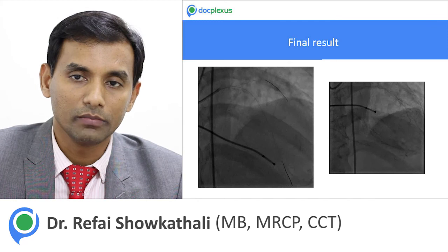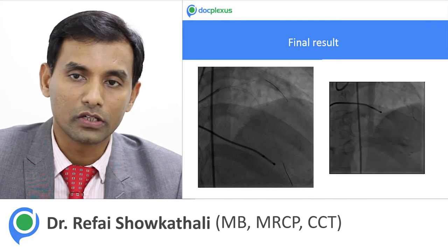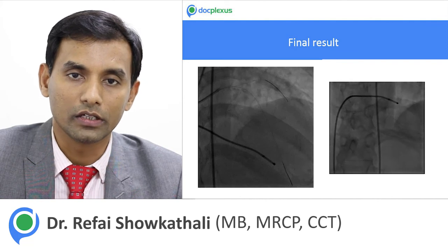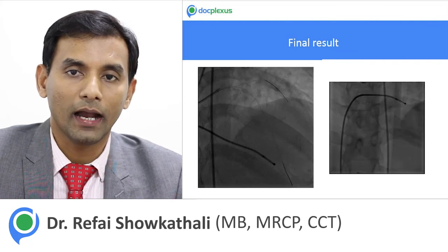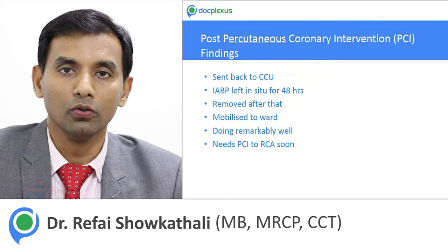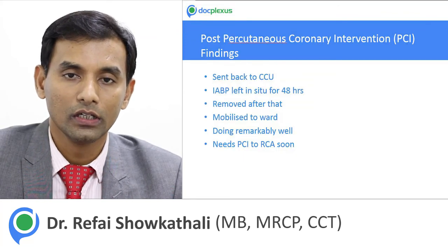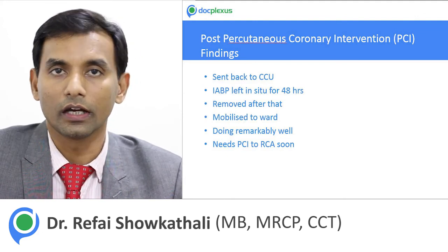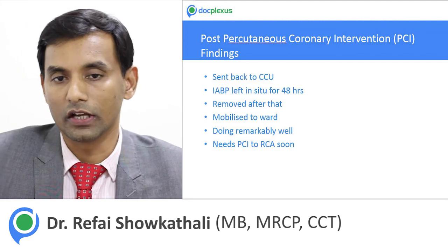He had an excellent TIMI-3 flow down the left mainstem into the LAD, and he had fantastic results after the angioplasty. He was sent back to the coronary care unit, and the intra-aortic balloon pump was left for 48 hours and was removed after that. In a day or two, he was mobilized to the ward, and he was discharged 2 days later, and he's doing remarkably well since his angioplasty.